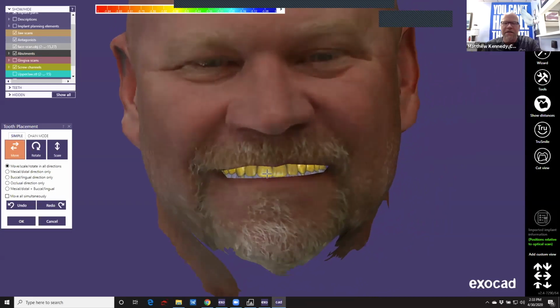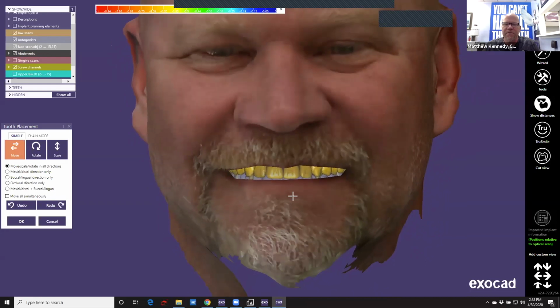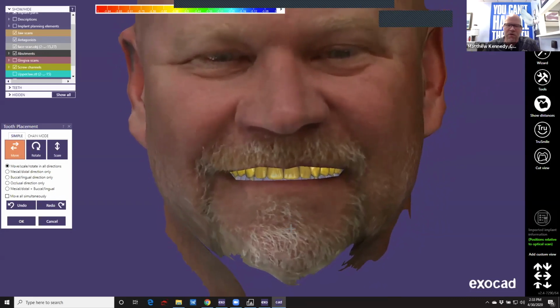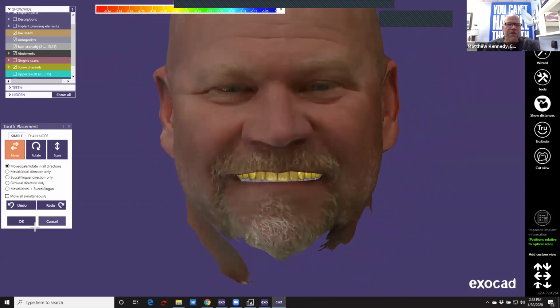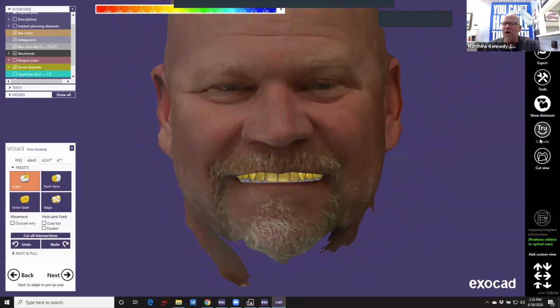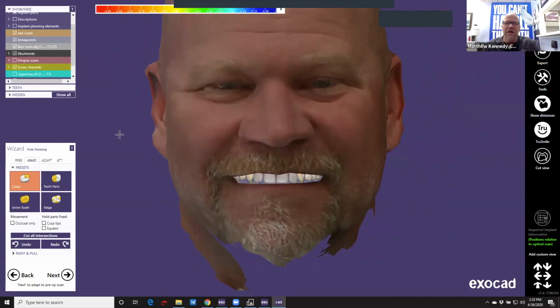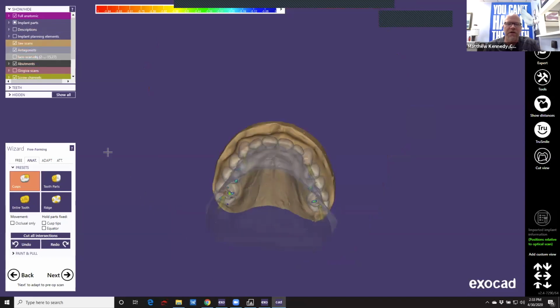The other thing the face scan helps with, when we do our denture try-ins, if we have an image of the face, it really eliminates having a cant to your setup. You know, we're used to working with models with no face. As soon as we get this face, it gives us so much more information. And that's really been key to this all being a success. I just think that the face has been a wonderful add-on to everything we do.